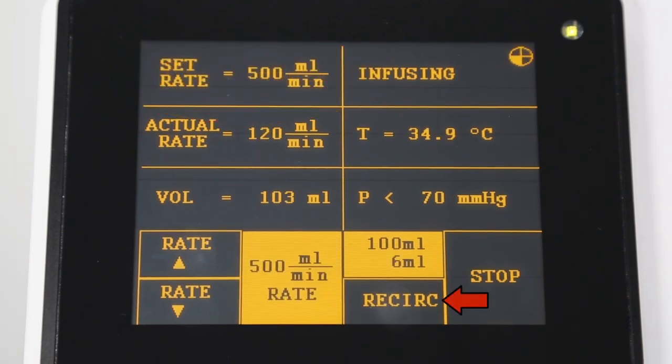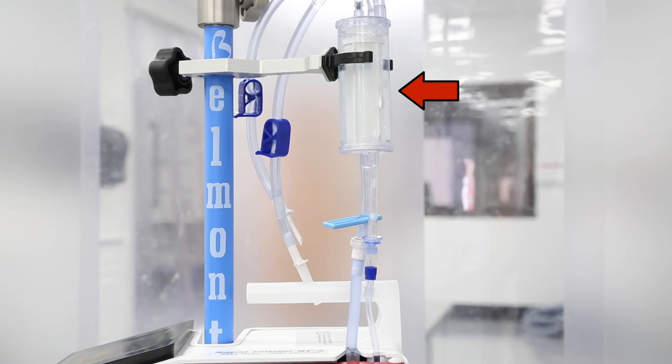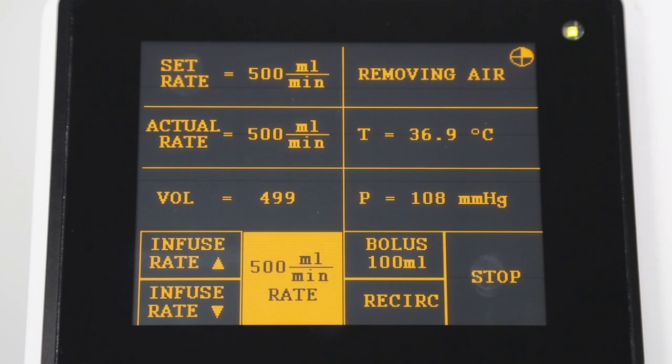Pressing the recirculation key will recirculate fluid through the reservoir and disposable circuit. This feature is used to warm and mix fluids and will automatically stop after 5 minutes. As fluids are warmed, gases are formed. The Belmont Rapid Infuser RI2 will trap these gases within the system and automatically purge them into the atmosphere. When this occurs, removing air will be briefly displayed on the screen and you may see bubbles escape through the recirculation or vent line.